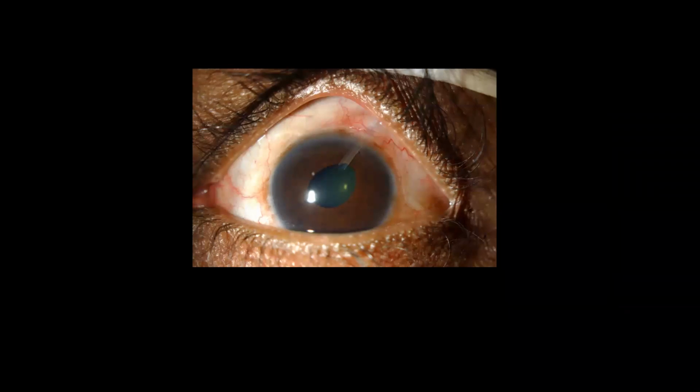Assalamu alaikum. So Dr. Abdullah, this patient underwent a glaucoma surgery. So describe what you see in front of you. So this is the slit lamp photos of the right eye. We can see the lens looks normal, the superior conjunctiva looks thinned, and it appears that there is thinning of the conjunctiva. I'm not sure if it's covering the tube well or not.